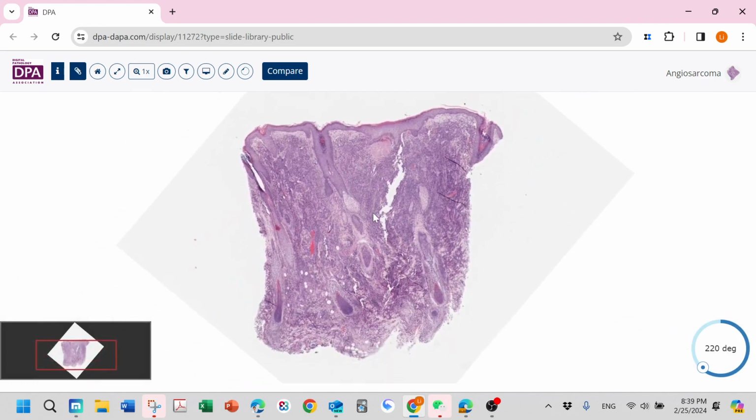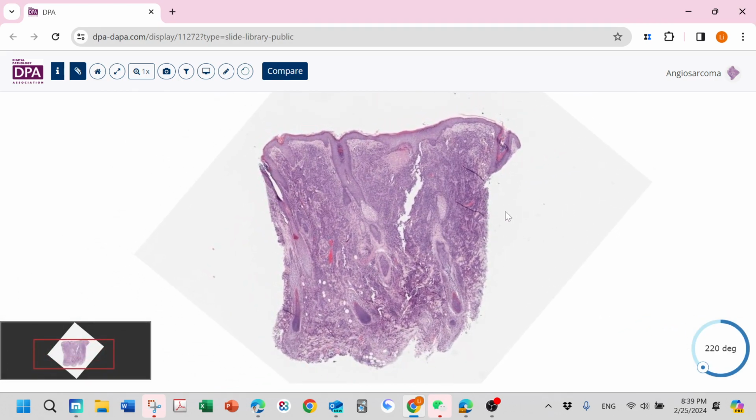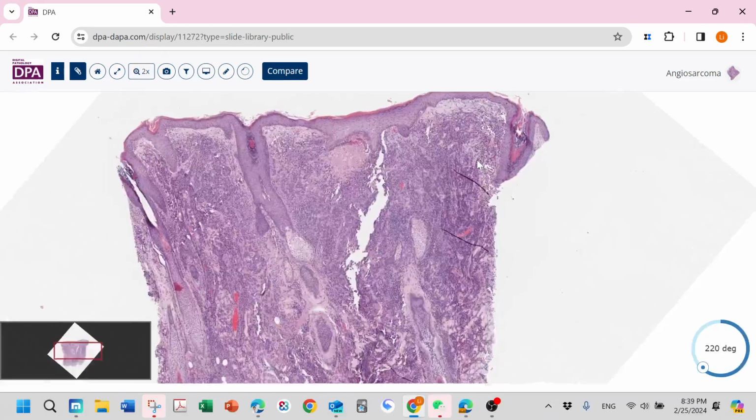This is another angiosarcoma. For this excision or maybe a deep punch, you can see all the dermis just infiltrated by tumor cell. You know, when you see this infiltrated growth, really dark, even into the subcutaneous, everywhere, highly suspicious for malignancy. Even at low power, we can see this is really hypercellular, really busy looking infiltration of the dermis. And then we can see this slit-like structure. You may think, what's going on? Is it artifact or true vascular channel?